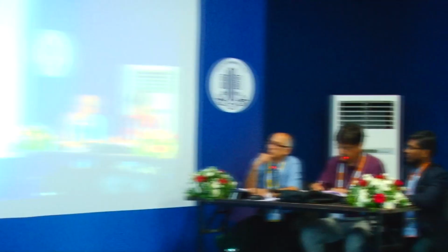So the factor responsible for visual loss, which is identified on OCT, is the presence of cystoid spaces and DRIL, where there is disruption, damage, either thinning or disorganization of the layers. So did you identify any damage to the structural layers of the retina which was caused by this?